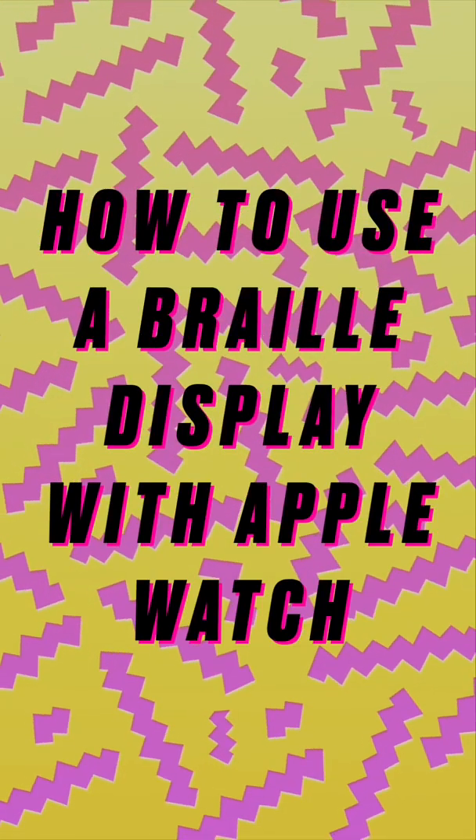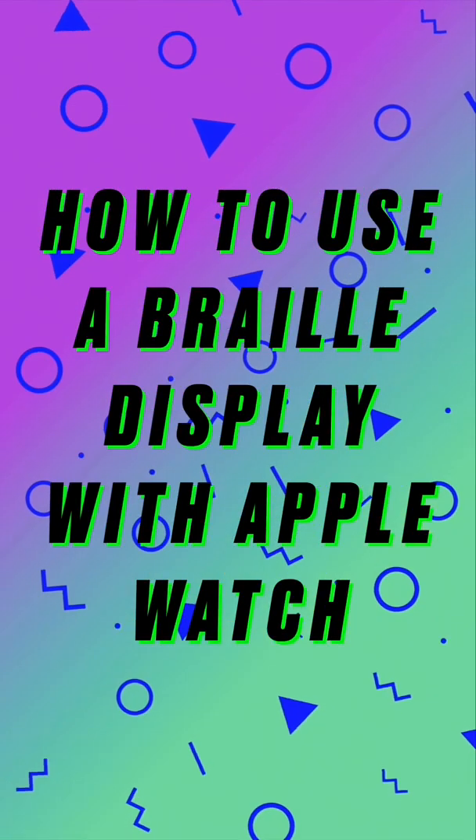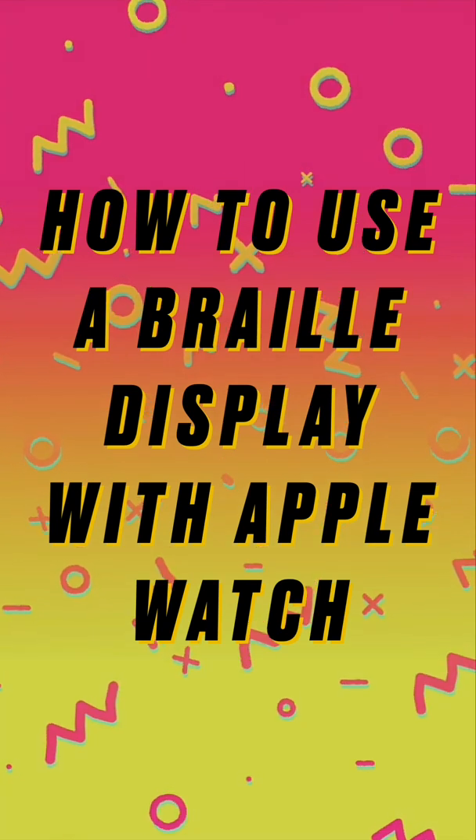How to use a Braille display with the Apple Watch. WatchOS 7.2 is required.